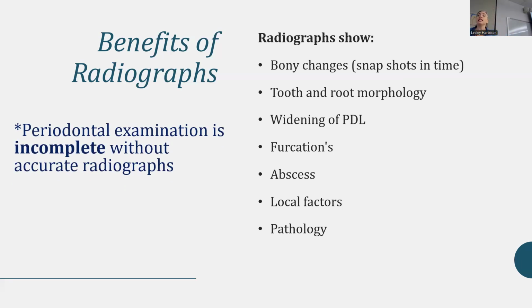A periodontal examination is incomplete without a full set of x-rays. So that's what we have to try and educate our patients about. We don't want to x-ray them to death. We don't want to take them when they're not necessary, but you can't have a complete clinical exam and find out all you need to find out if you don't take a complete set of films.